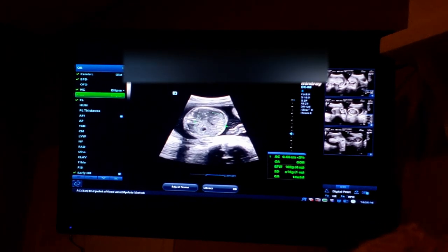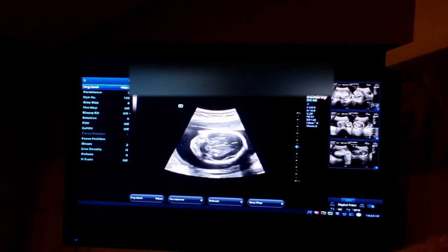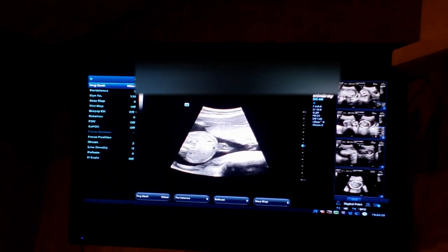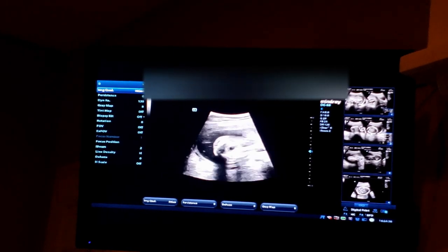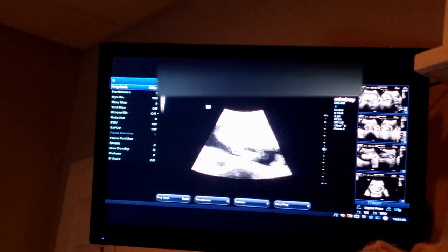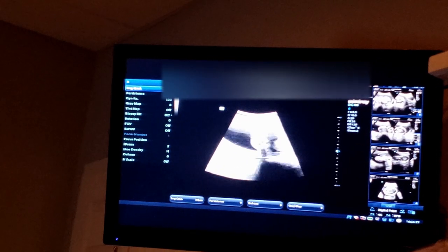This is belly again, before we see how big around it is. Okay. I'm going to look at the brain structures now. Looks good. We'll look at the renal arteries, perfect. That means we have kidneys. That's nice. Yeah, I'm not looking at you, I'm looking at this baby. Check that lower spine again. Very good.